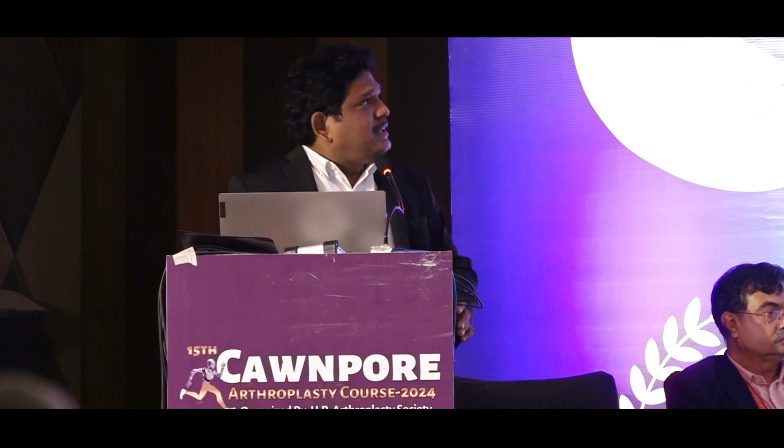After arthrotomy, the patella may be adhered to the underlying bone or tissues, and it may require release or osteotomy. A thorough debridement of synovium from both the gutters and the suprapatellar area is required to visualize the joint line. Slowly one should attempt to flex the knee after raising a medial subperiosteal flap and releasing tight structures as required.